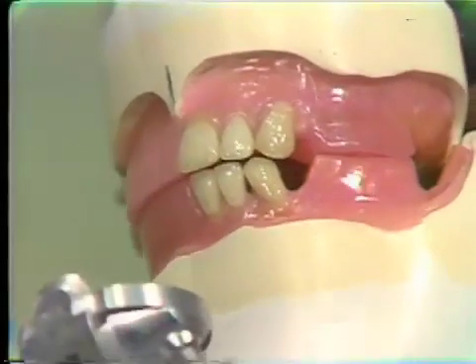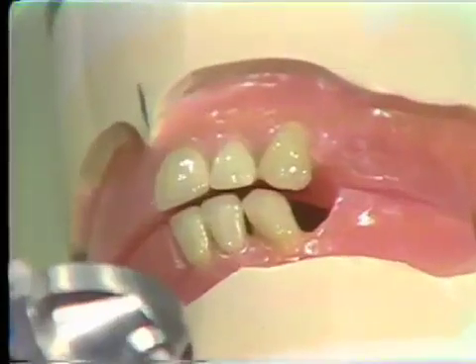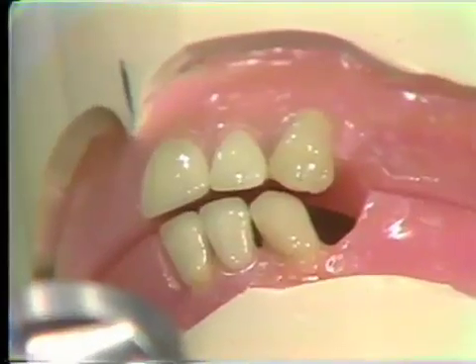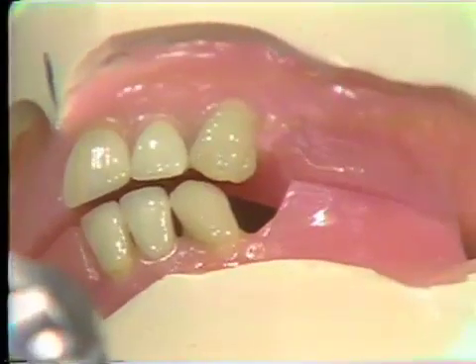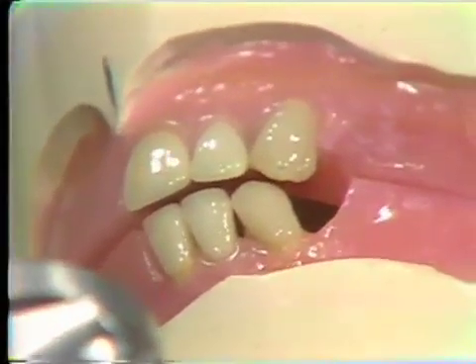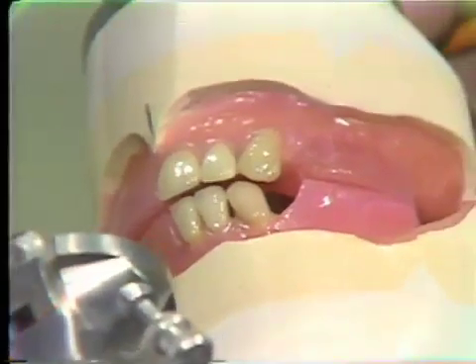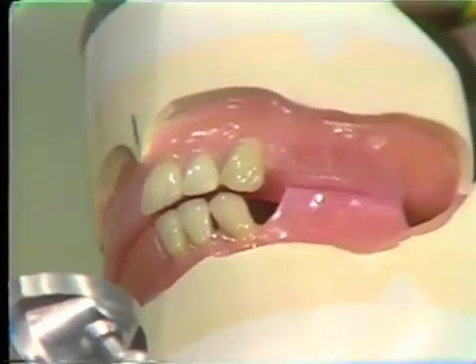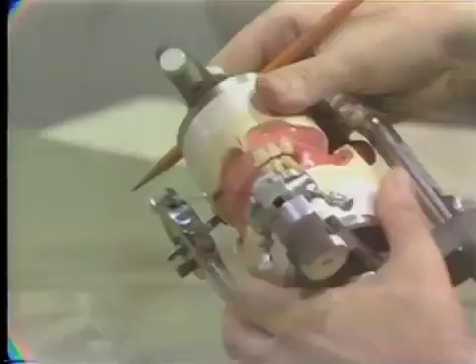And as I tip this up, this emphasizes the fact that anterior denture teeth are not in contact. We do not lock in the denture. And you can see, as guided by your well-adapted occlusal rims, we end up with the space between the teeth at the given vertical. And this is what we want to accomplish. Now, a couple features of the lower cuspid.